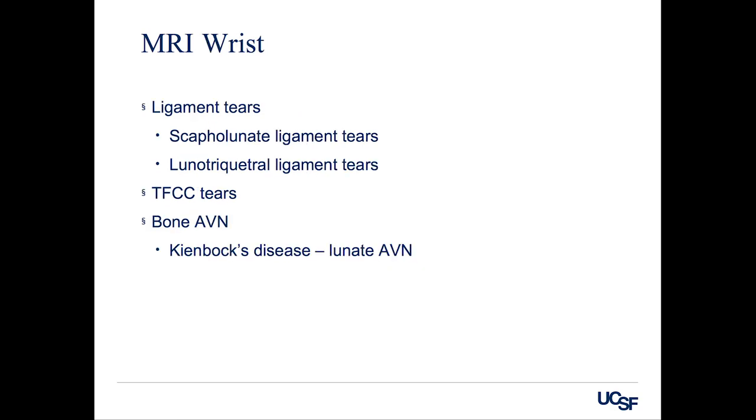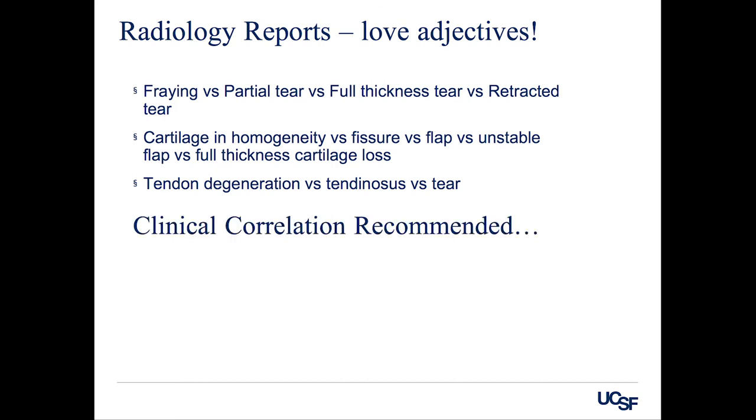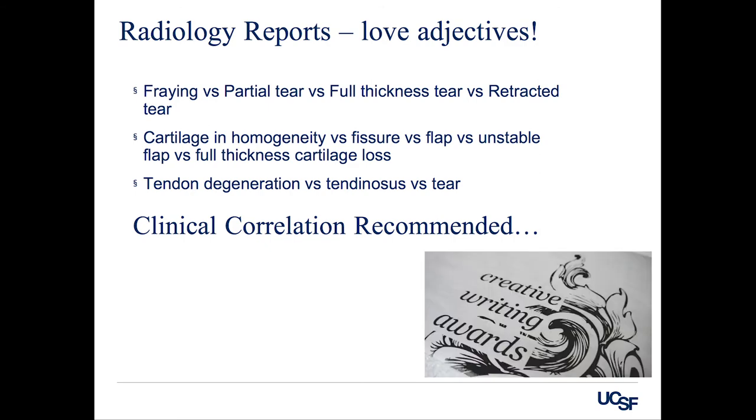Okay, so coming down here, we know that radiologists, they love to use adjectives in their reports. So they'll give you lots and lots of things to talk about. And it's your job to kind of decide what's important. And then they'll add clinical correlation recommended. Okay, so that, of course, that's the most important part. But let's go through a couple of these things that we've seen in our patients. Okay, so here's one.